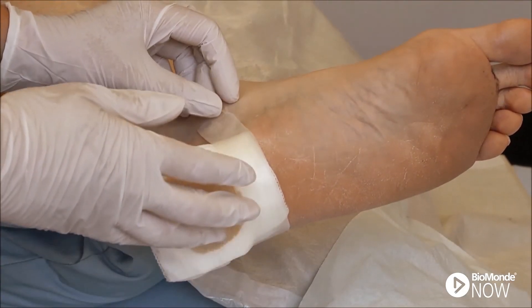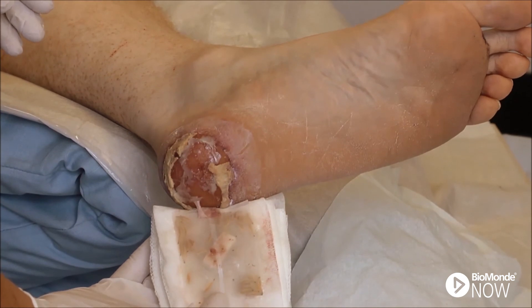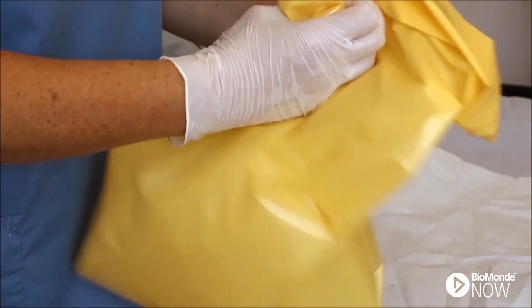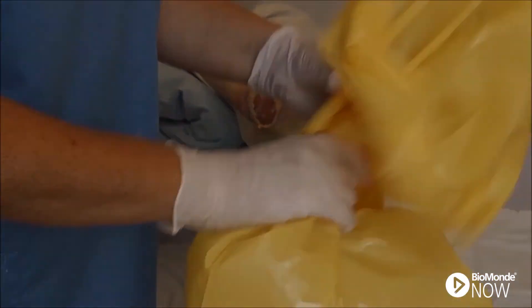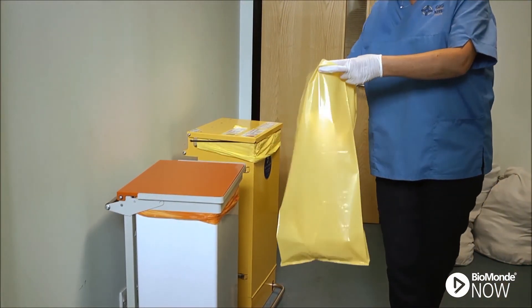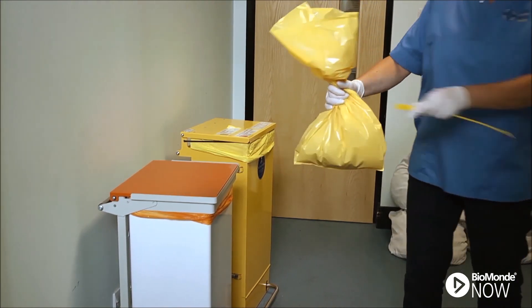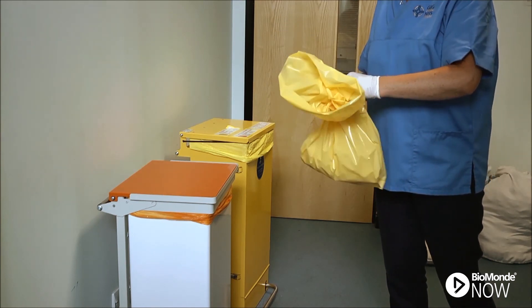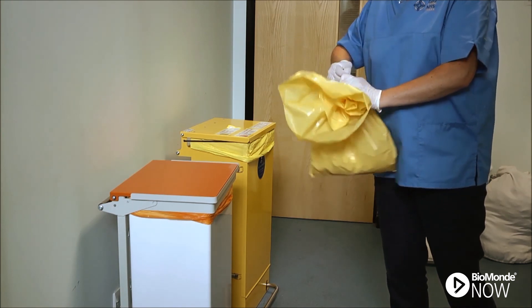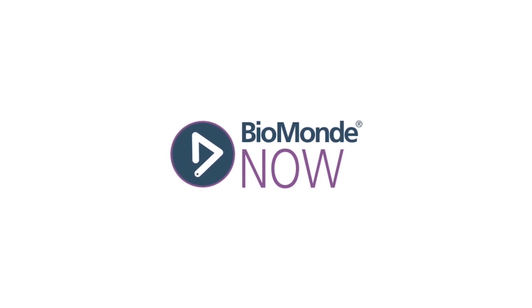When the treatment is complete, remove the larvae and outer dressing. Once removed, place the larvae in a clinical waste bag. On disposal, double bag the larvae and dressings. Consider the larvae contaminated dressings waste and dispose of as per local policy.